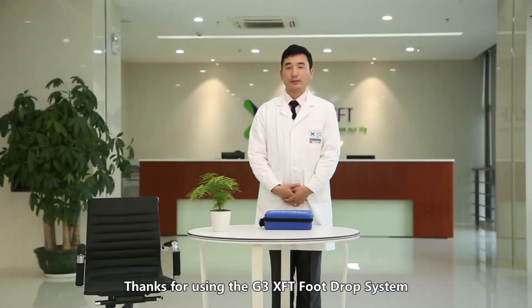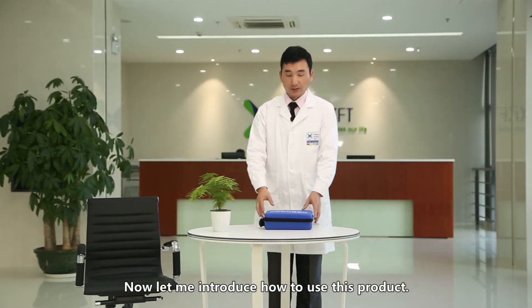Thanks for using the G3 XFT foot drop system. Now let me introduce how to use this product.